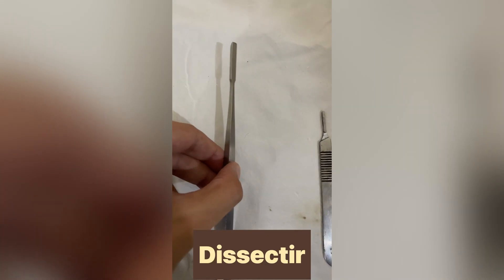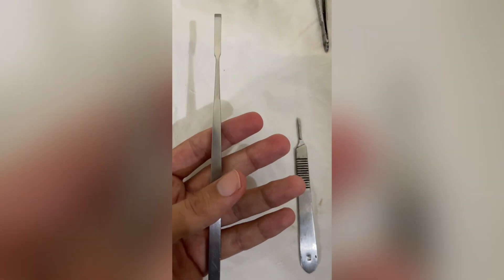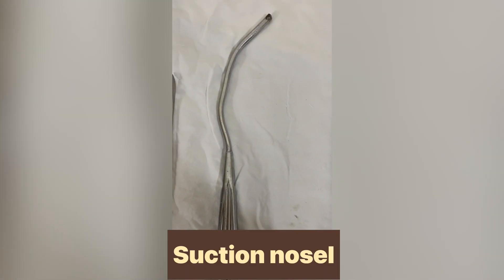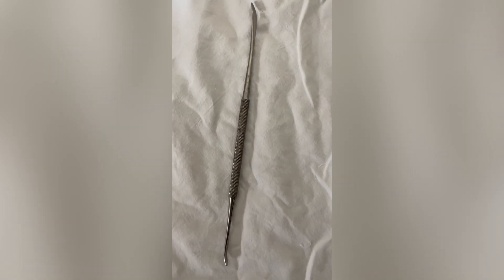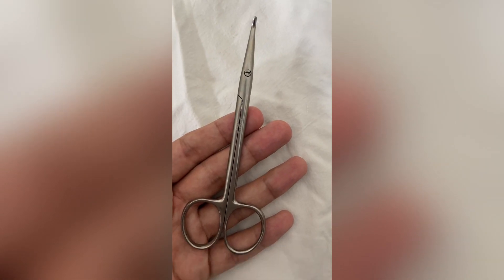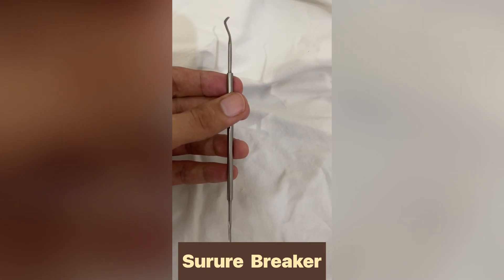This separates the cornea from its attachment to the sclera. This is used to remove fluid collection. To elevate the periosteum from bone in a confined space.